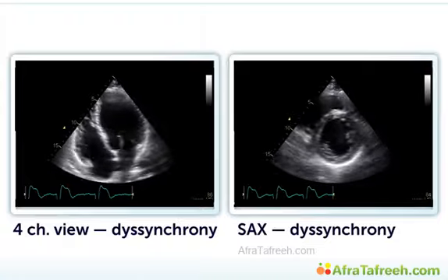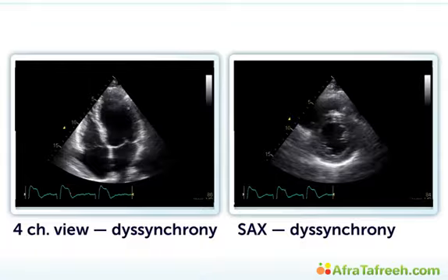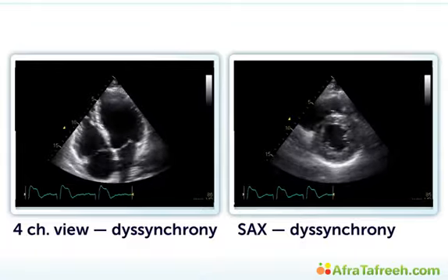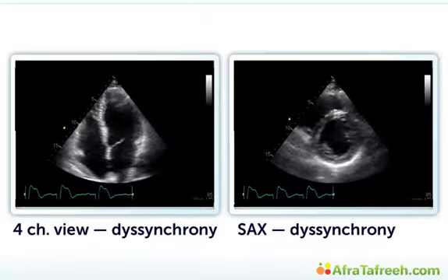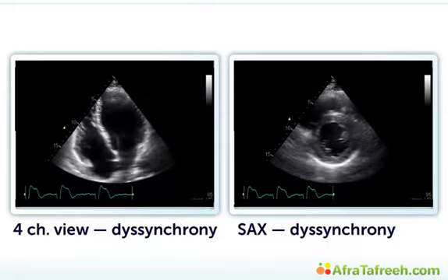Well, to give you the background, this is an echocardiogram of an athlete who was able to participate in a marathon. So the patient has normal left ventricular function even though it appears to be reduced. And this is very typical for left bundle branch block.